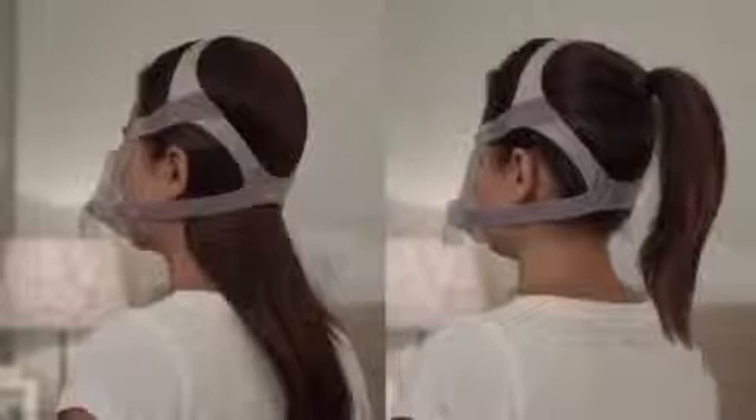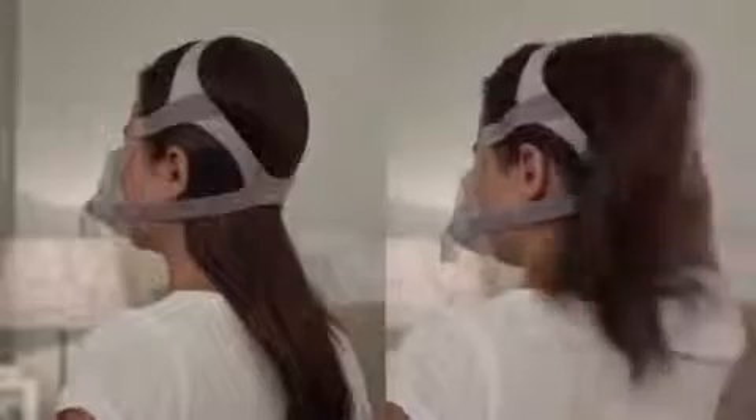ResMed has the hair management needs of women covered, too. You can position the lower part of the headgear over or under your hair to suit your hairstyle preference.